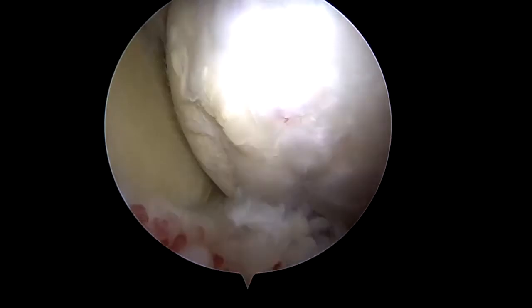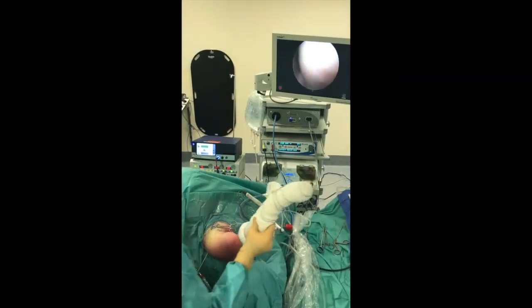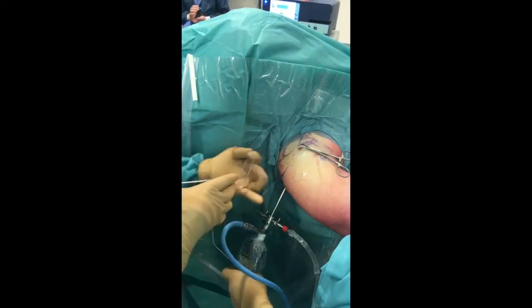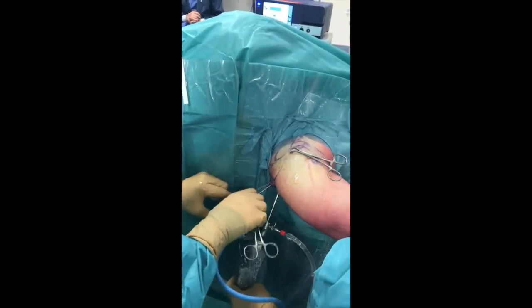Stability testing confirms humeral stability throughout shoulder abduction and rotation. The bone-linked button is finally secured with surgical knots, definitively locking the construct.